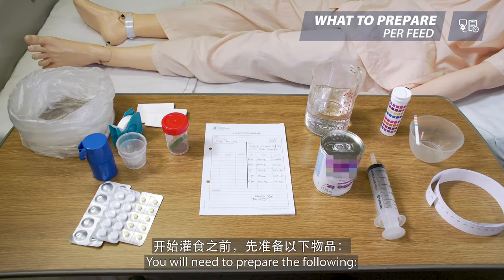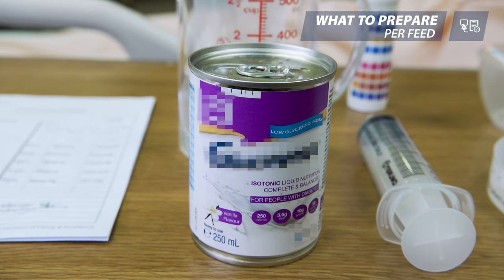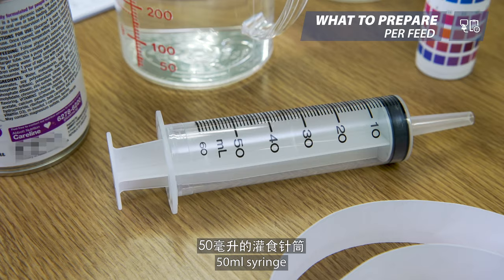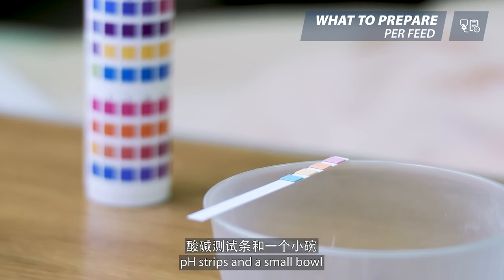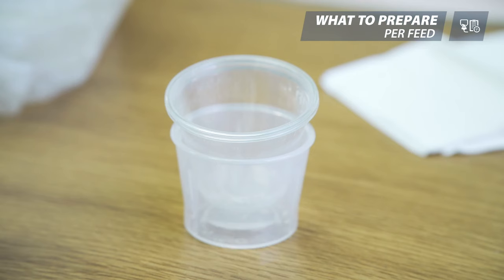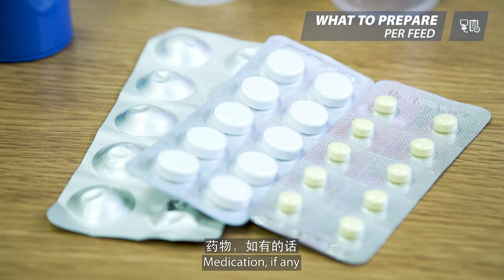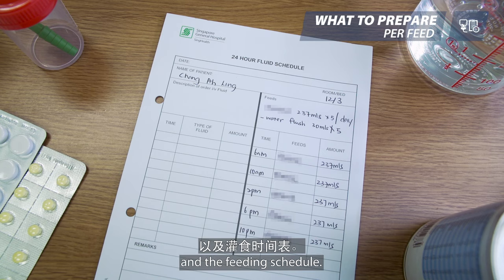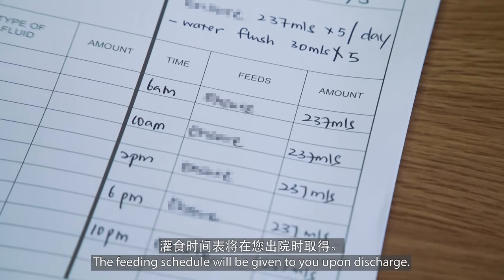You will need to prepare the following: oral nutrition supplement as prescribed, 50 ml syringe, a jug of water, pH strips and a small bowl, small cups, measuring tape, medication if any, and the feeding schedule. The feeding schedule will be given to you upon discharge.